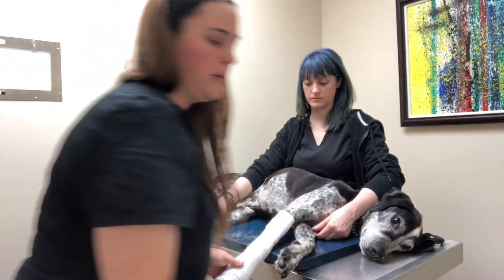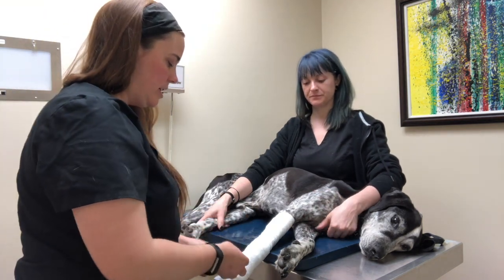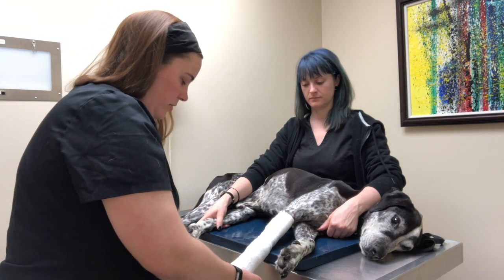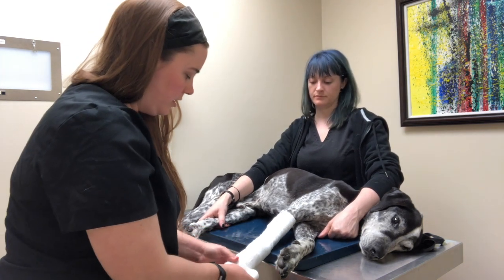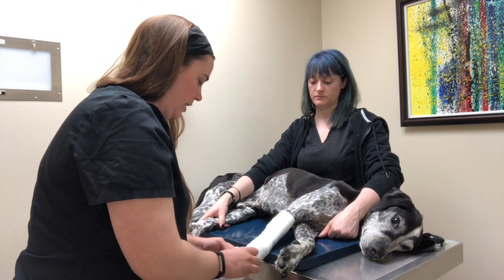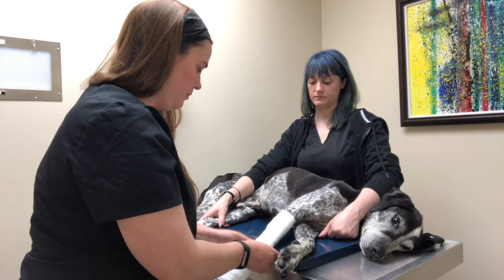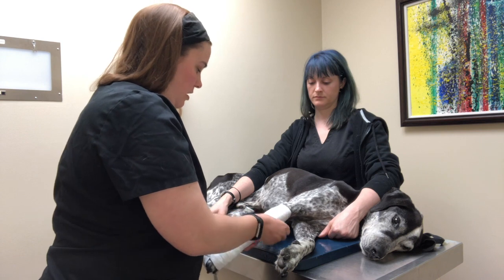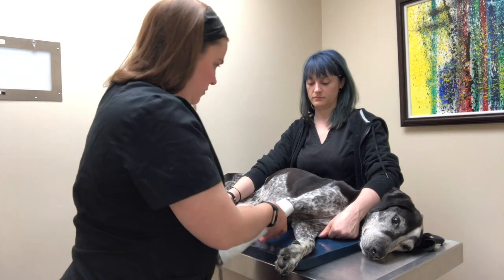So our second layer is going to be the compression layer. We're going to use some compression gauze. And again, we're going to start at the distal portion of our limb, and we're going to move proximally up, still leaving our toes out of our bandage. And this layer is going to compress our cotton padding, our cast padding. So we want it tight, but we don't want it too tight, so we don't cut off circulation to our limb. And again, overlapping by 50% with no wrinkles or creases.